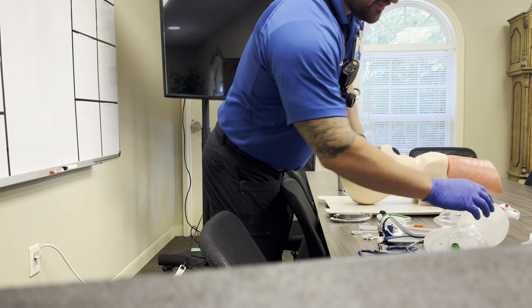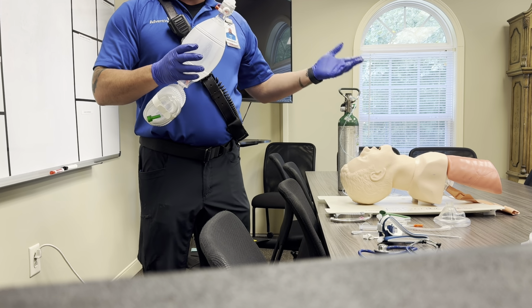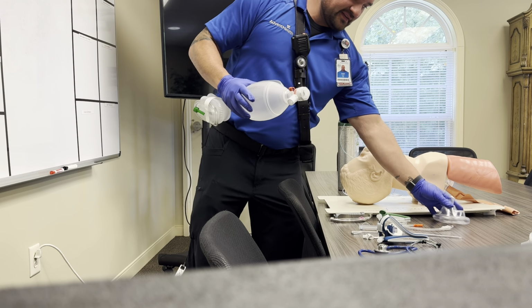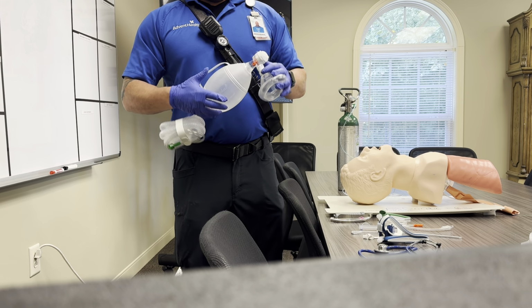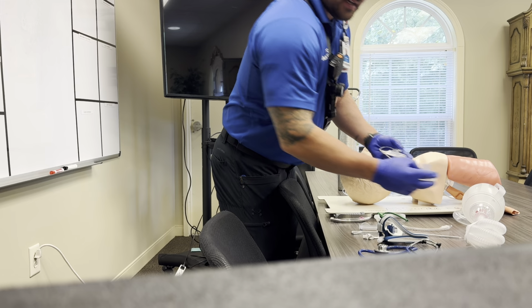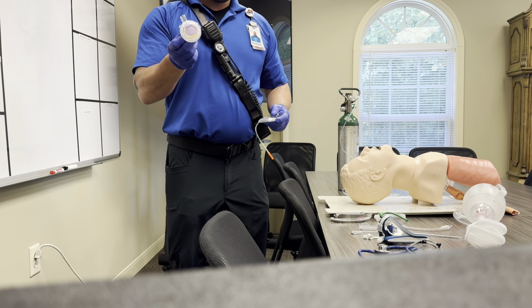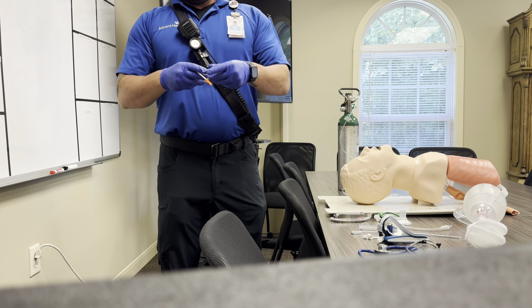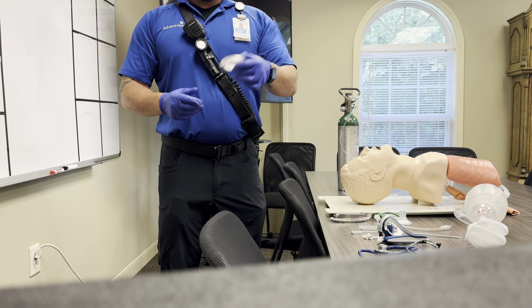And arguably the most important thing is a BVM. This is an adult BVM. Obviously use the BVM appropriate for your patient's age. We do have a mask that attaches to the BVM. And then I have two different CO2 detecting devices that I like to use. The first one would be the color changing that comes in the bag with the BVM, and the CO2 sampler that goes directly on the tube.